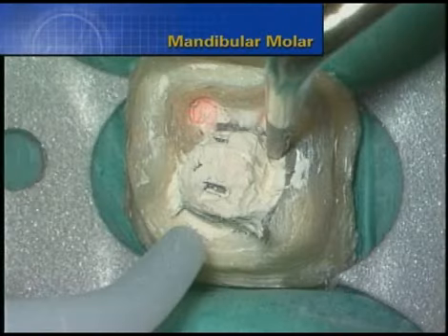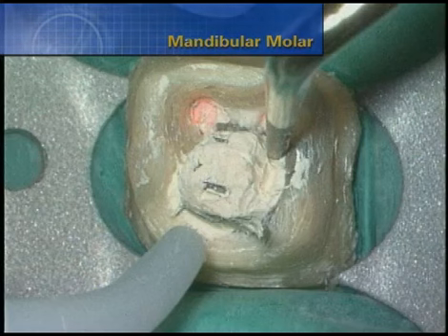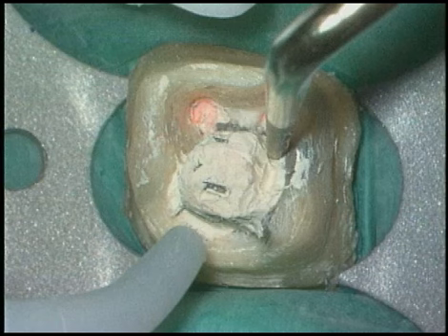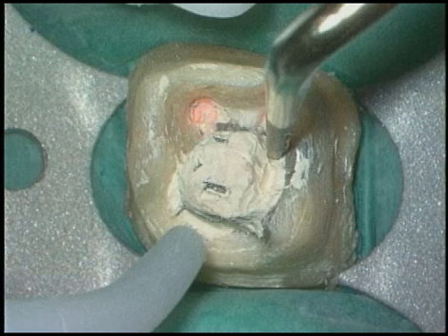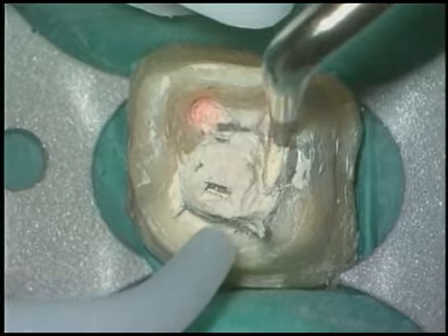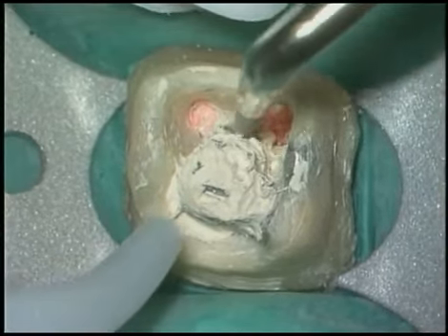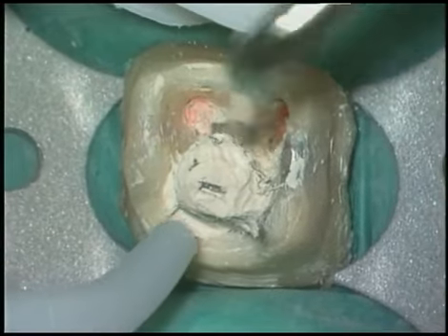Here is the occlusal view into a mandibular molar. The preoperative films revealed a threaded post in the distal canal. I am removing core material from the pulp chamber with a Pro Ultra Endo 2. This instrument provides unsurpassed vision because we can look down the shaft of the instrument and our line of sight is such that we can see the tip work and watch it sculpt away and break up debris.